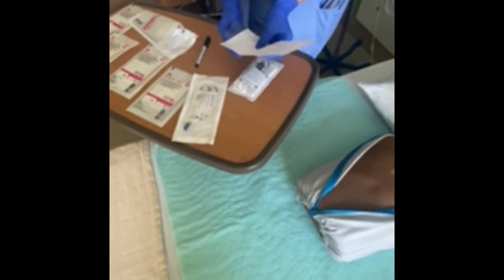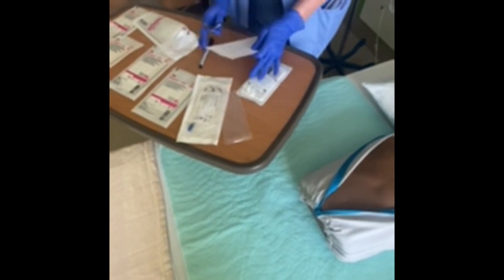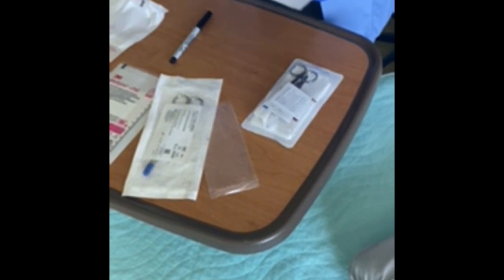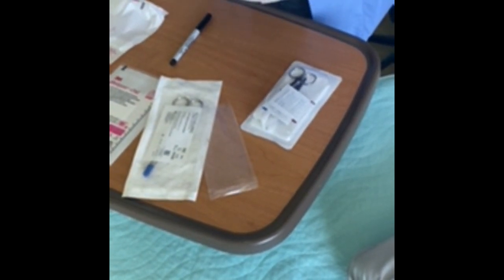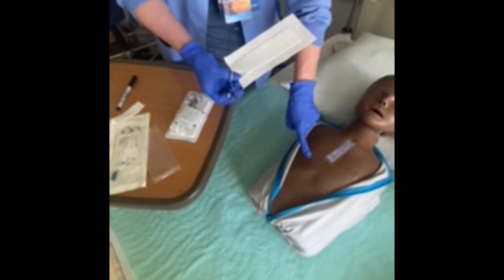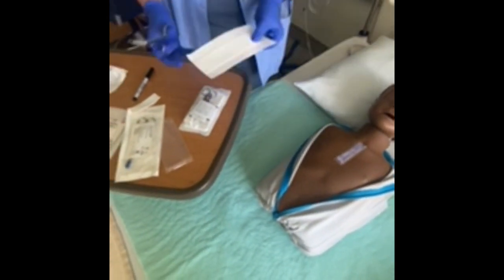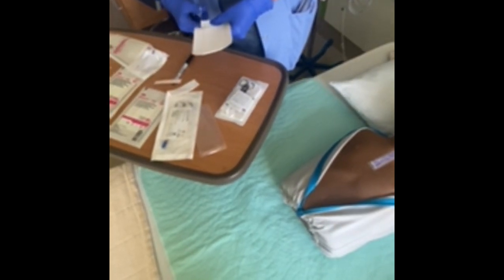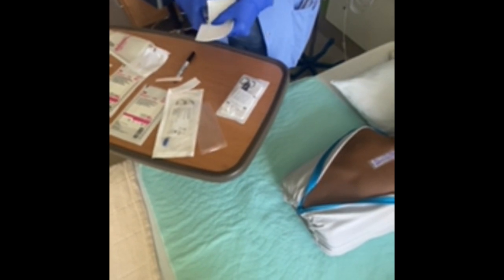So you can go ahead and cut down and then label. We're going to cut this part at the bottom where there is some air. Usually you will have a chest tube or a chest tube suture. The idea is to secure it but not have too much adhesive on the patient's skin.